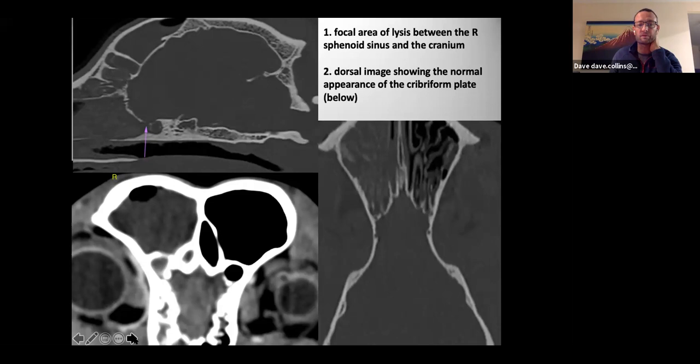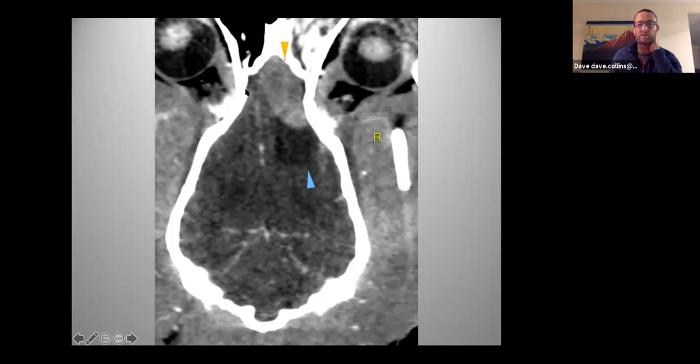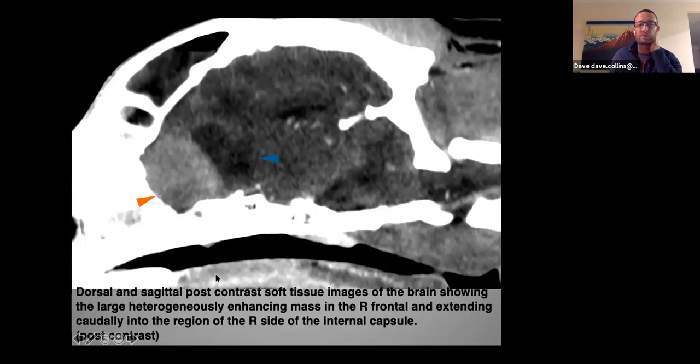Frontal sinus full of probably the same bloody mucus we're seeing externally, and you can see this dorsal section of the brain showing quite a large granuloma. And the sagittal section is also showing quite contrast enhancing, more rostrally and less so caudally. But yeah, quite a huge lesion there, and it's quite amazing how much brain dogs can function without. I'm continually amazed by that.